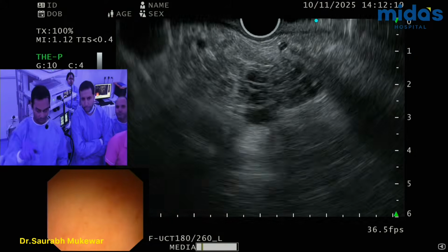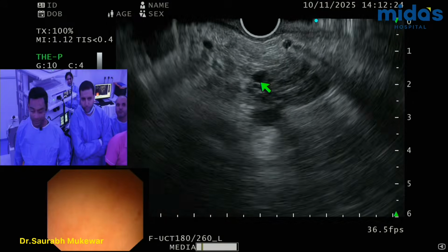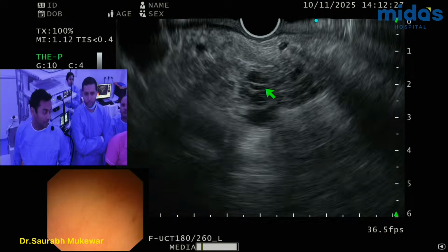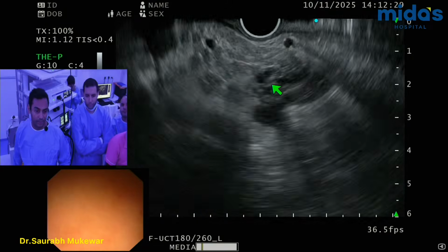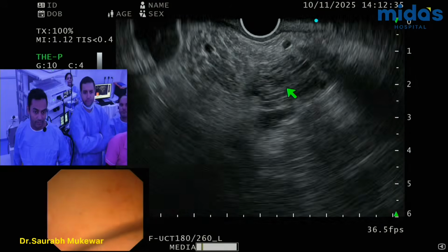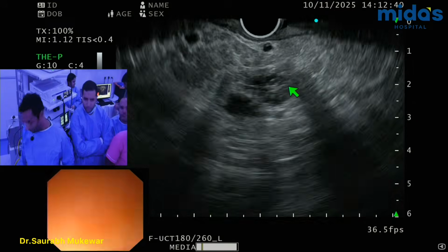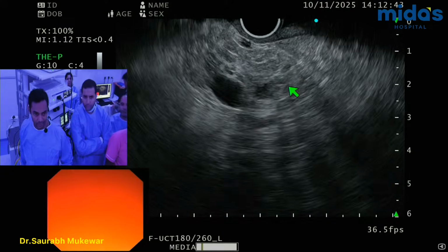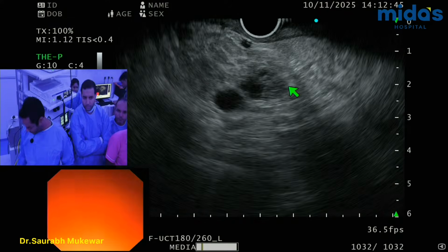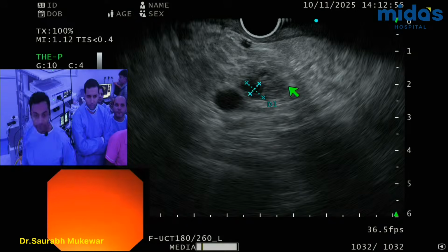And it's got what we call microcystic lesion. So you see these are small cystic lesion spaces. Guys, biopsy? Yeah. So these are microcystic lesions with septations right there. So this is actually a very, very classic appearance of a serous cystic neoplasm. All right. So the largest cystic component in that whole thing is this one. So yeah, it's a very small cystic component.